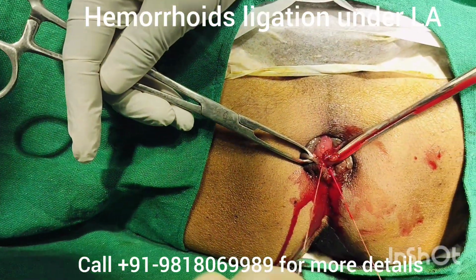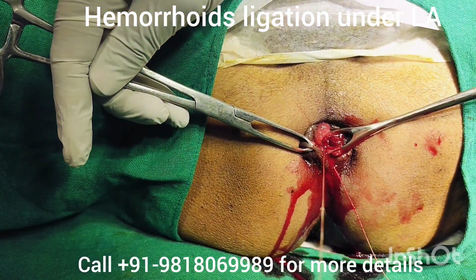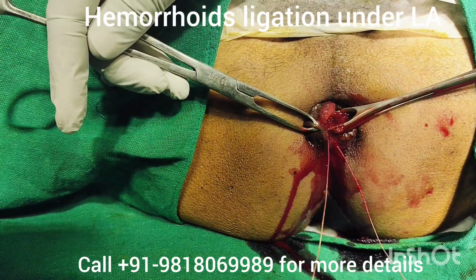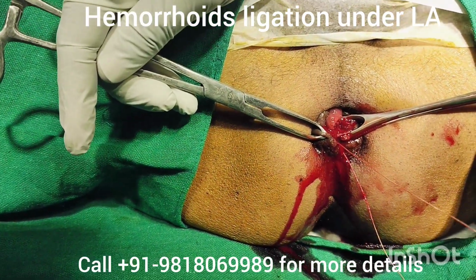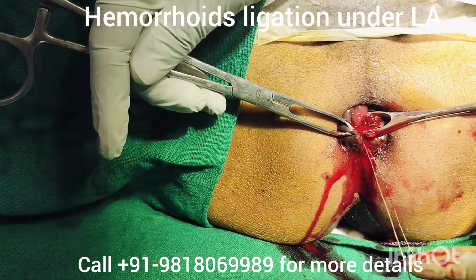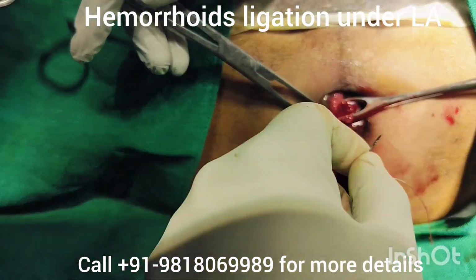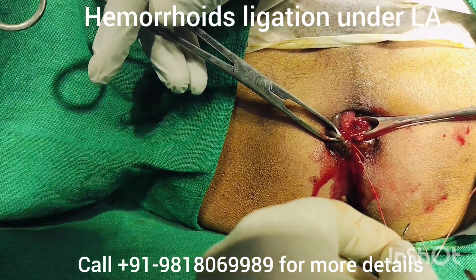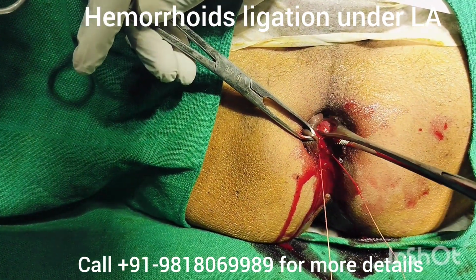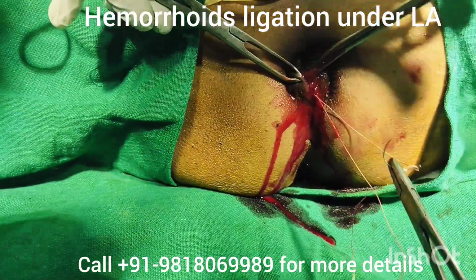Now by the same thread I will do another fixation of the pile mass at 11 o'clock position. For this I will put this remaining thread again in needle and then will transfix this pile mass at 11 o'clock. See, I have put the thread inside the needle, held it through needle holder, removed the clamp from 7, and clamp has been applied at 11 o'clock pile mass.